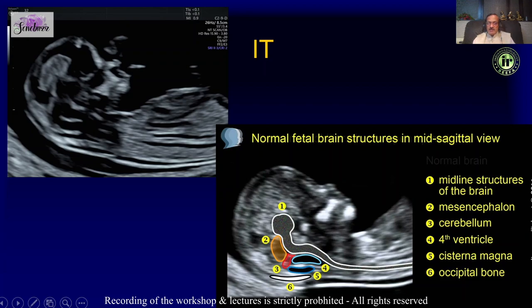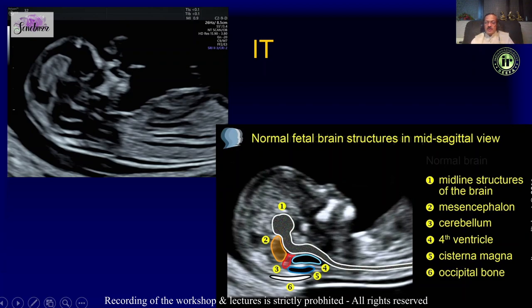Typically the brainstem, IT, and cisterna magna have a ratio of 3:2:1 — as you go from top to bottom there is a slight decrease in size. This can be very important in picking up either obliteration of the IT or an increase in the size of the IT.